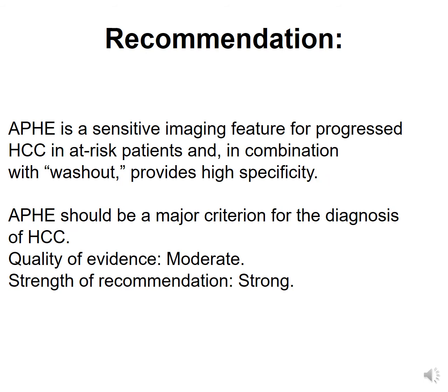So the recommendations are that the arterial phase hyperenhancement is a sensitive imaging feature for malignant HCC in the at-risk patients, and in combination with washout provides really high specificity. Now, it should be a major criteria for the diagnosis of HCC, which is shown by the moderate evidence, but remains a strong recommendation.